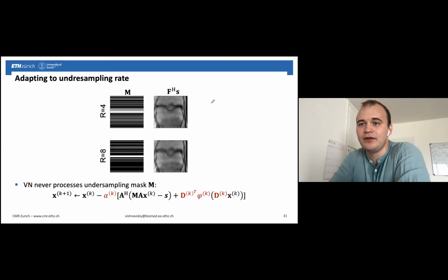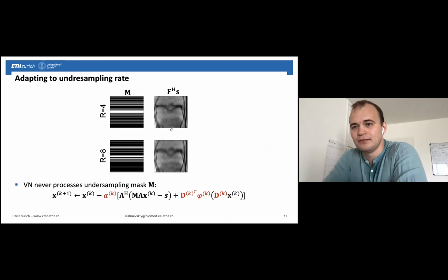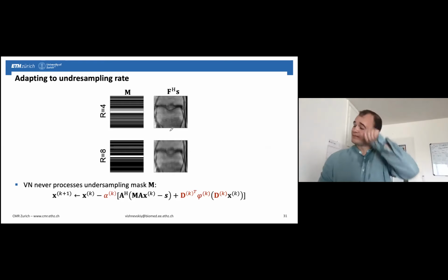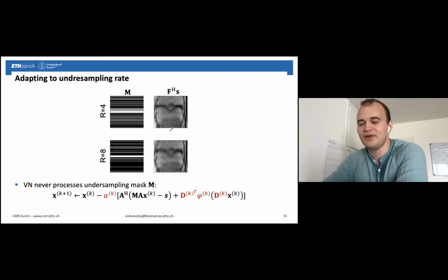They look quite different for different acceleration rates, and it adds variability to the training data, effectively. So the network sees more and more diverse data, and the diversity comes from the fact that we allow different acceleration rates. And I think that it can be seen as some sort of implicit regularization. So if it addresses the question, I'm not sure.